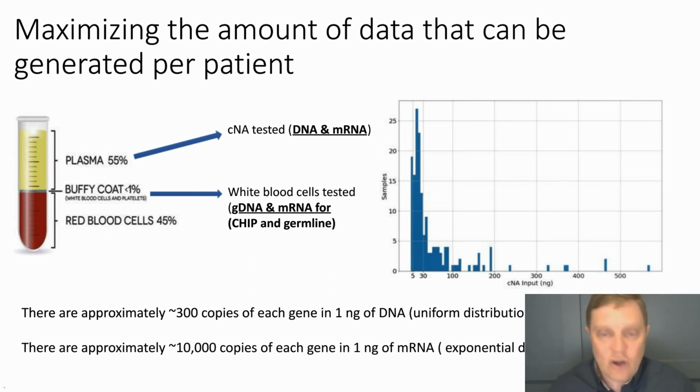We're doing PCR as part of next generation sequencing. And so you can sequence 30,000x depth of coverage or 50,000x depth of coverage if you want, but that's not adding additional information, because at the end of the day, we're not adding in hundreds of nanograms of underlying material. We're lucky to get 20, 25 nanograms of material. And so it's that biological input that is rate limiting.